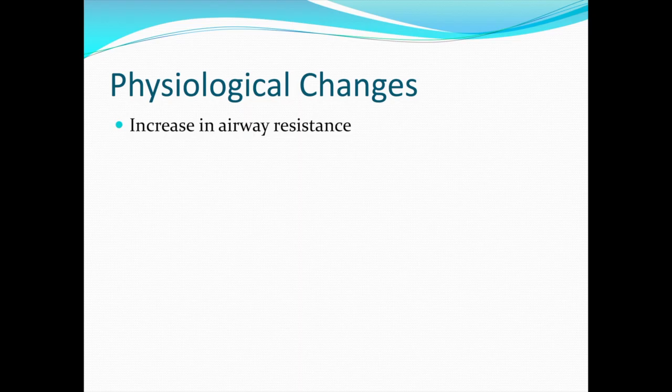Assuming that you have a laminar flow, by the Hagen-Poiseuille equation the resistance to airflow is inversely proportional to the fourth power of the radius of the tube. Therefore, obstruction in the airway causes a marked increase in airway resistance. Intrinsic PEEP also increases due to impedance to the expiratory flow and insufficient time to complete expiration. A PEEP of up to 35 centimeters of water has been reported with a size 7 tube, but this usually remains below 20 with a size 8 tube.